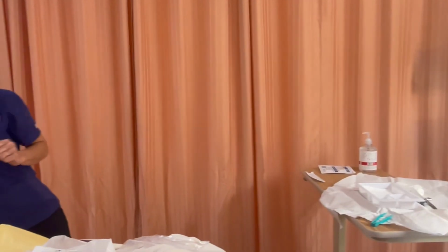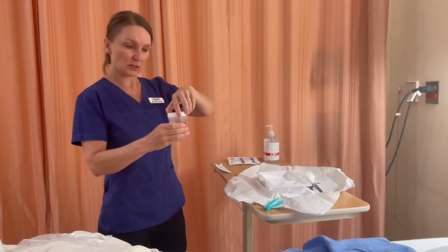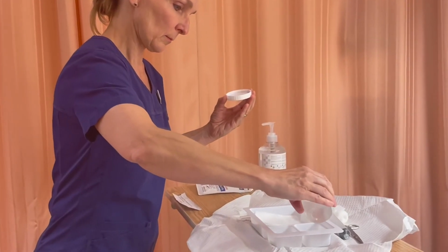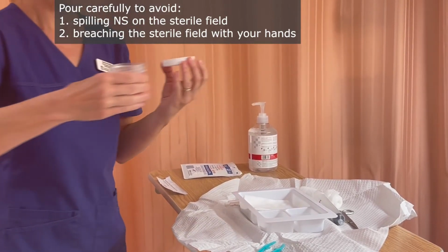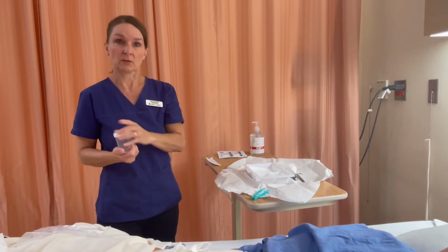I'll just grab my normal saline. I had that moment where I paused to consider what else I might need. This is a fresh container, and I'm going to pour my normal saline. And I am complete with setting up my tray.